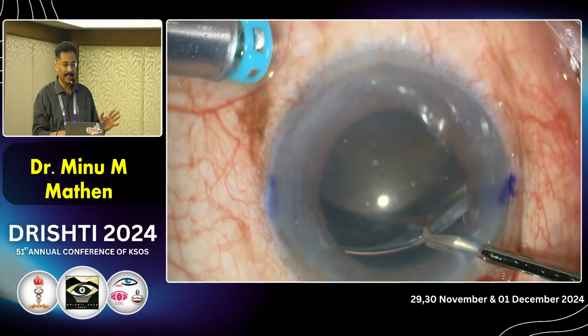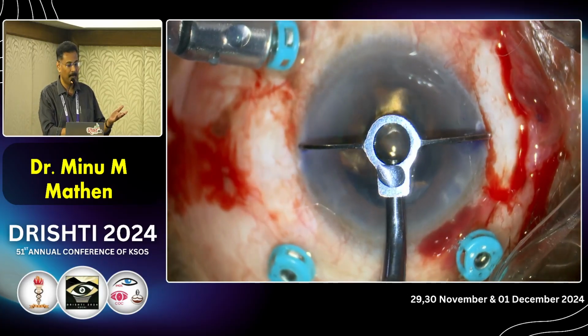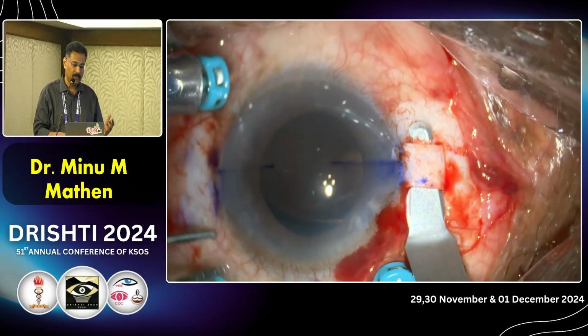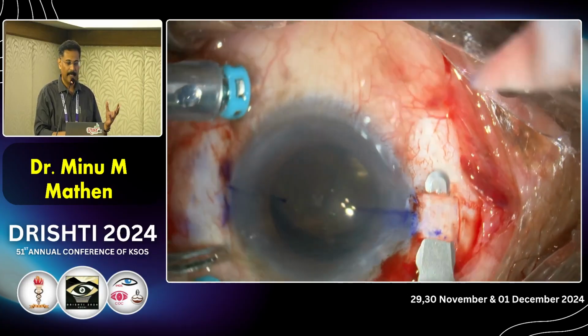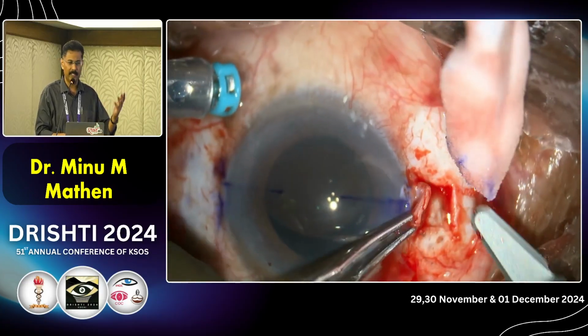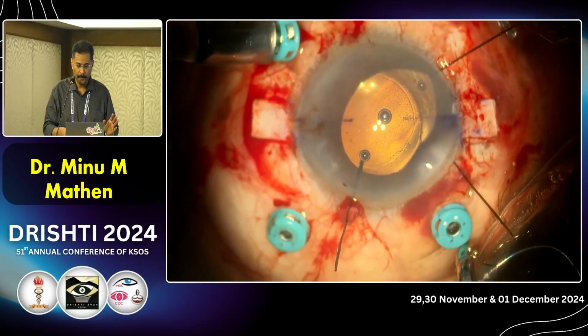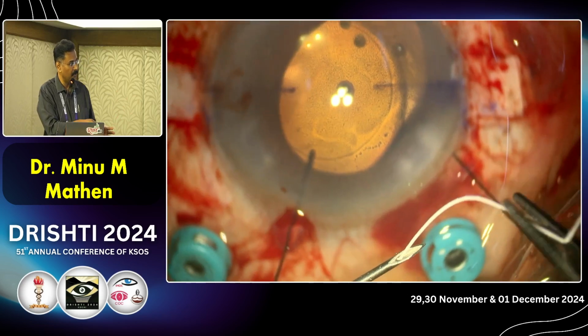So expect this. And CTR, so I'm using the help of our VR person. He brings up the complex. So this is one way to refix the bag without opening it, or you can always just remove it and do a regular glued IOL. So the flaps are made now, and then open up one area where you have to see the haptic optic junction.